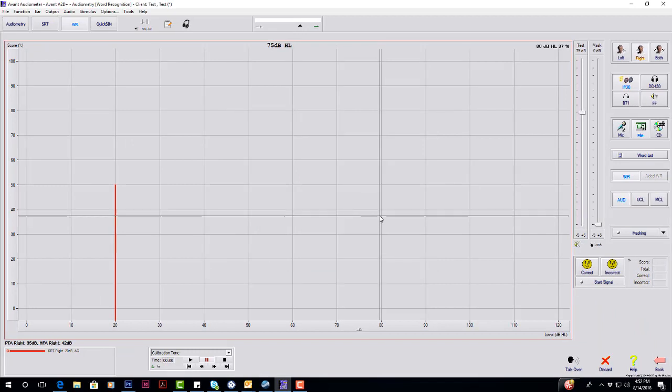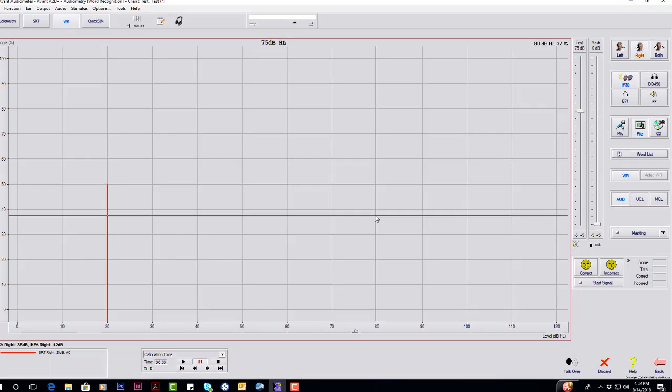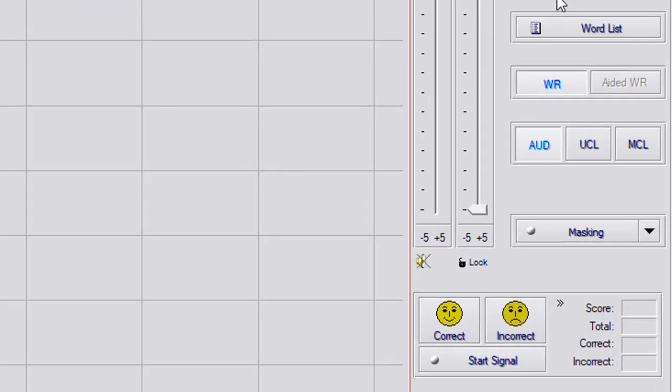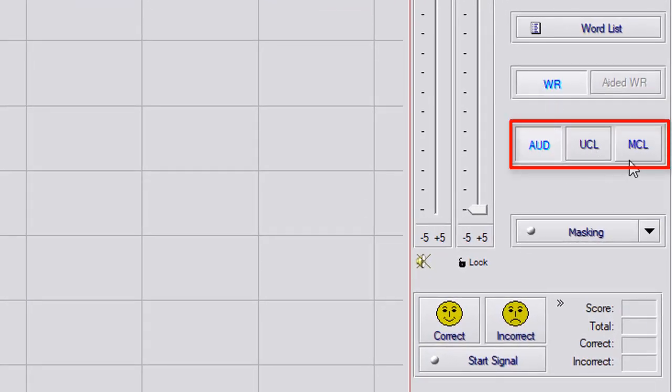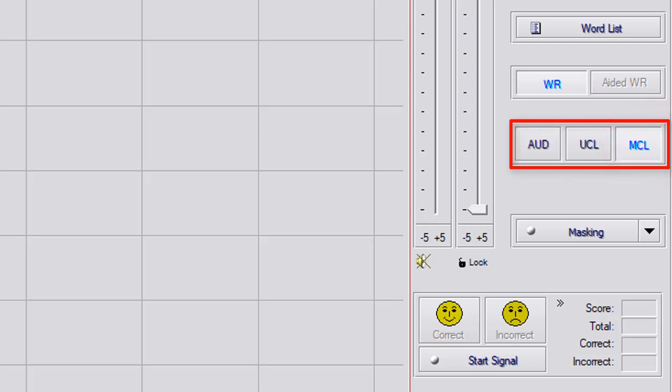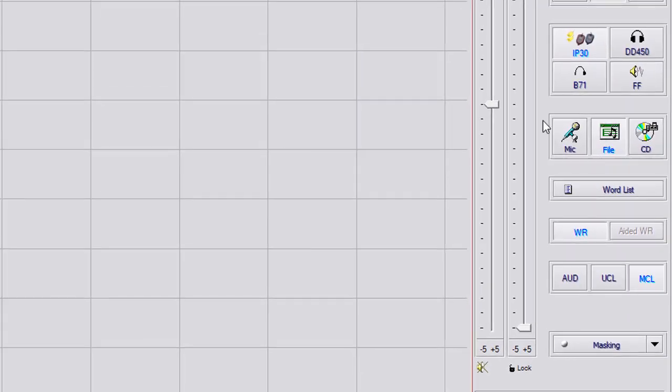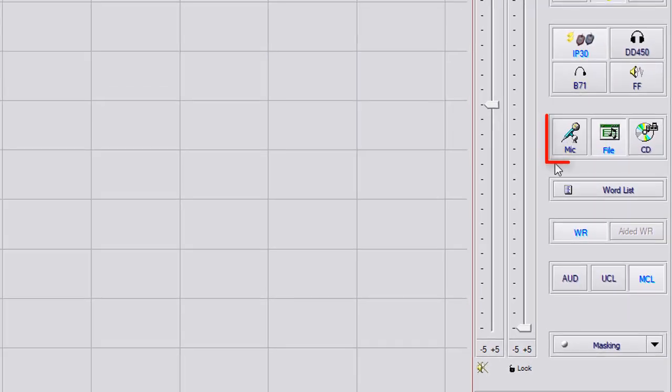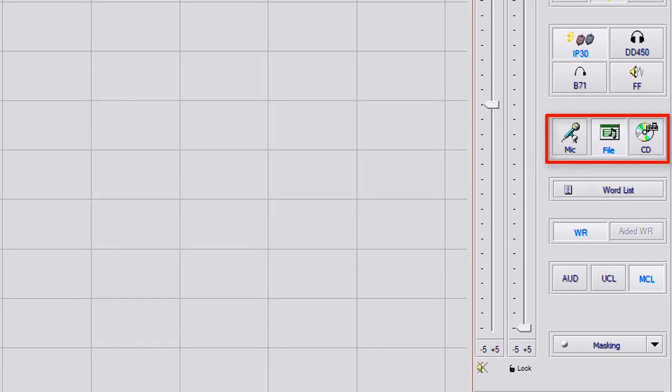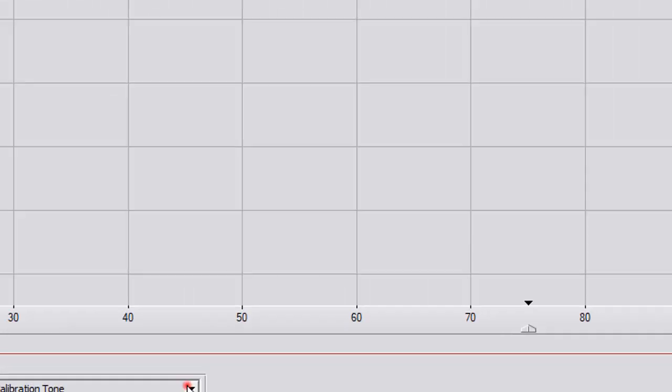If you're wanting to use MCL for your word recognition, you're going to start with that first. So on the right hand side, you have AUD, UCL, and MCL. If you select MCL, you can use the microphone as your stimulus or you can use file and use one of the built-in word lists down here at the bottom for cold running speech.